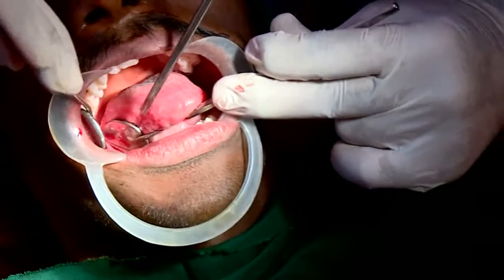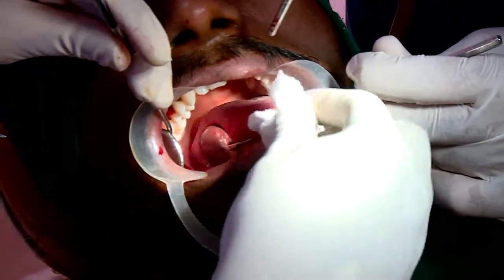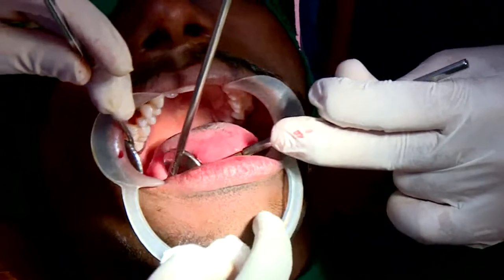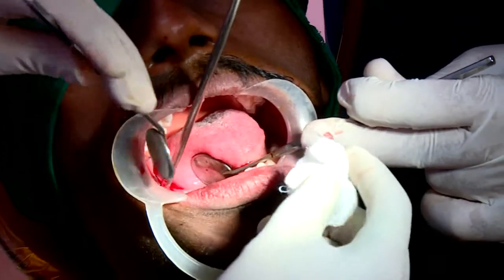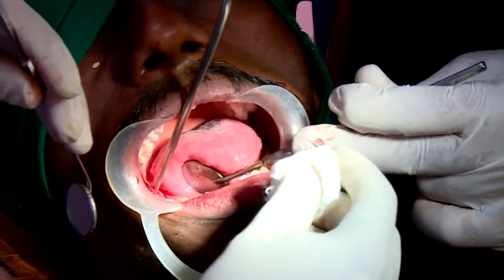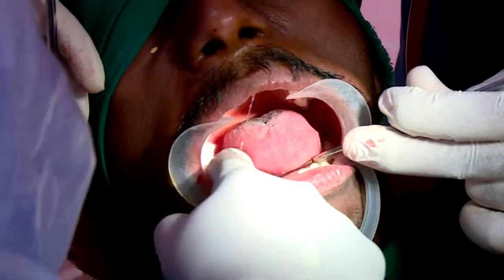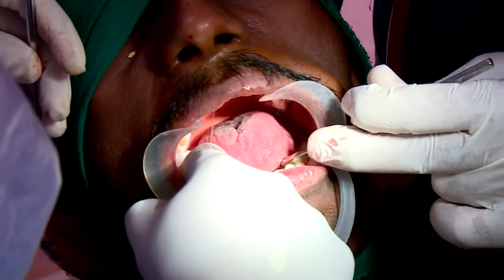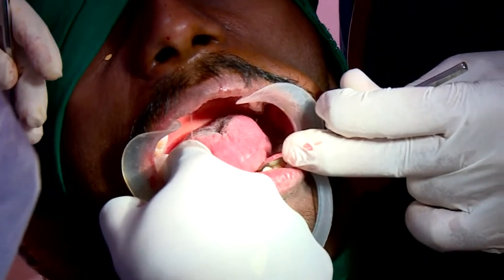Hello sir. Sir, the suturing has been completed. As you mentioned, the tight suture is placed on the distal aspect of 7. This is just to prevent any periodontal pockets in future. Once the suturing is done, a small gauze piece with gentle pressure is given to check for hemostasis.